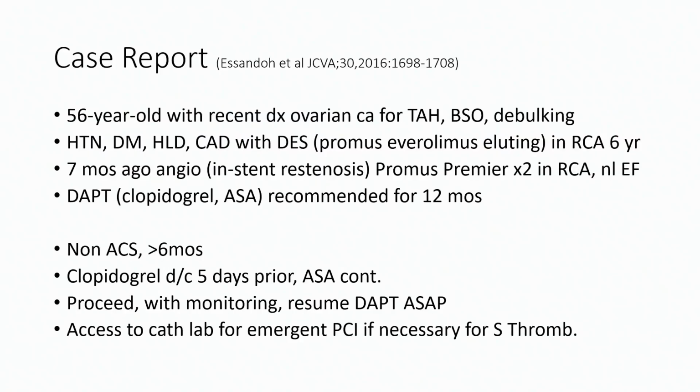So going back to our case, what did we end up doing? Since the patient had a non-acute coronary syndrome stent placed, and it has been more than 6 months according to the guidelines, if it is an elective procedure, it should be okay to proceed. However, this patient has angiographic risk factors, multiple stents. So if this surgery were able to be delayed, ideally it should be delayed for a year. But this patient has cancer, so we need to proceed.